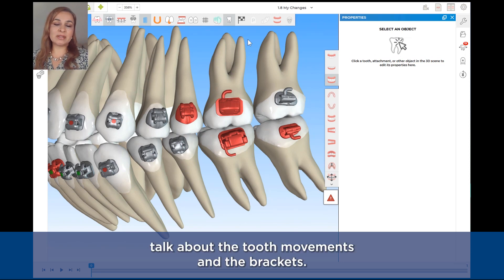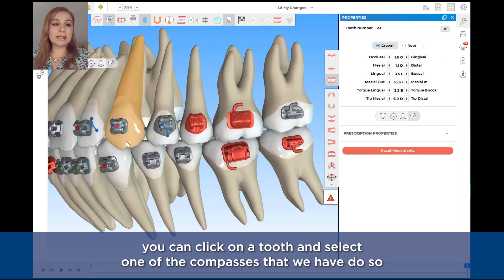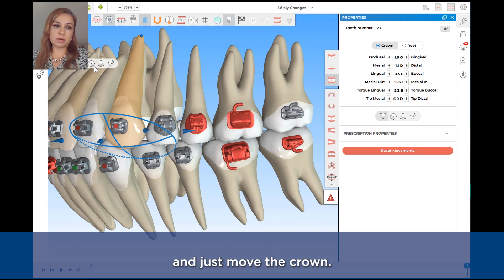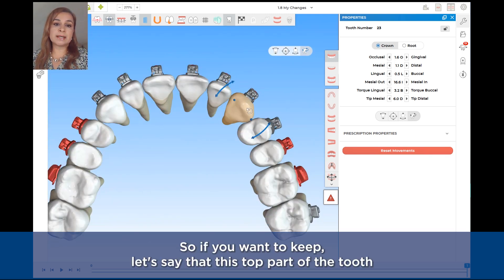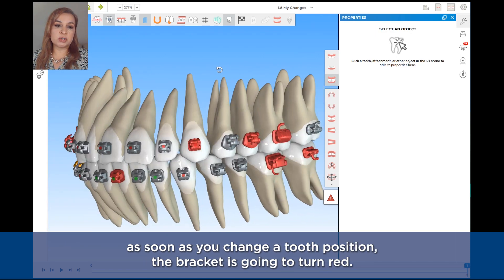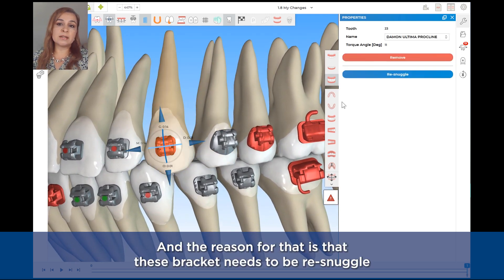Now let's talk about tooth movements and brackets. If you want to make changes to the final tooth position, you can click on a tooth and select one of the compasses. The first compass maintains the root position and just moves the crown. The next one is the bodily movement. The third one keeps the crown and just moves the root. The fourth compass is the hinge movement — if you want to keep the distal part of the tooth and just rotate the mesial, you can use this. You will notice that as soon as you change a tooth position, the bracket is going to turn red, meaning that bracket needs to be re-snuggled.